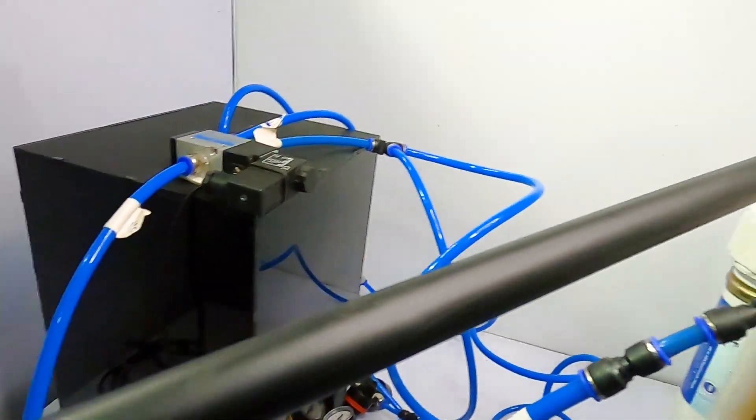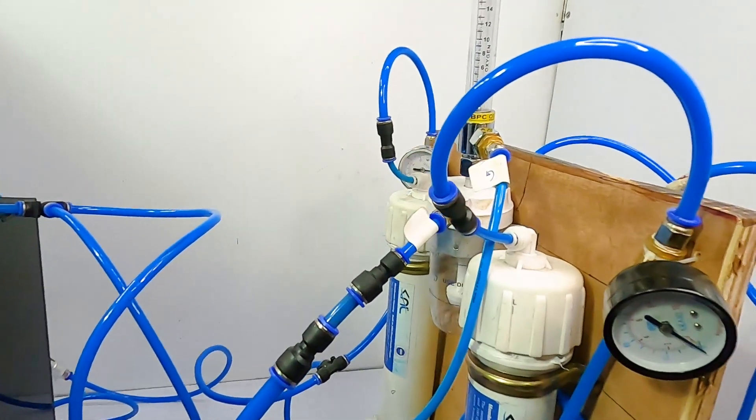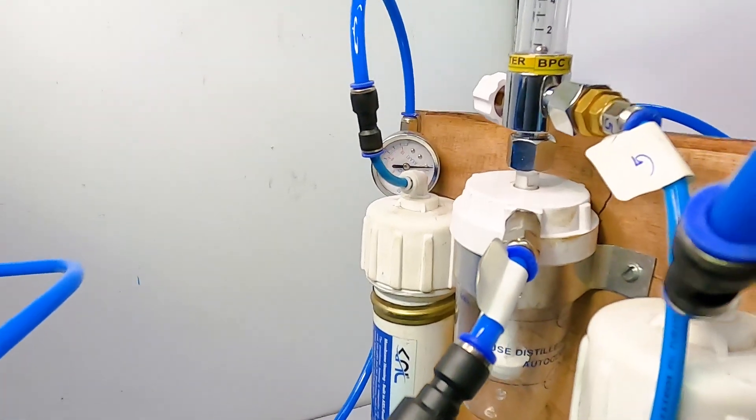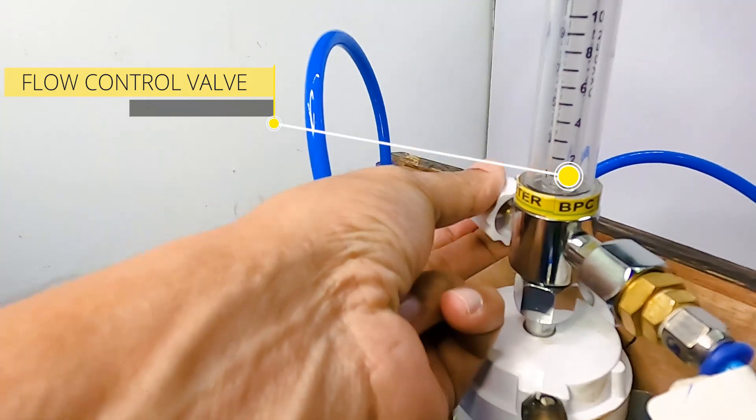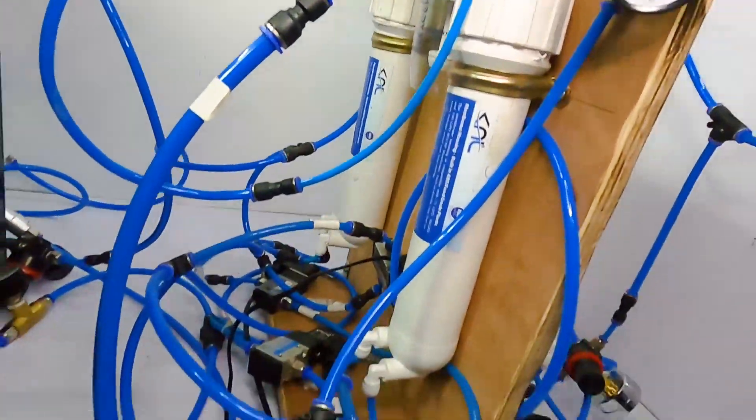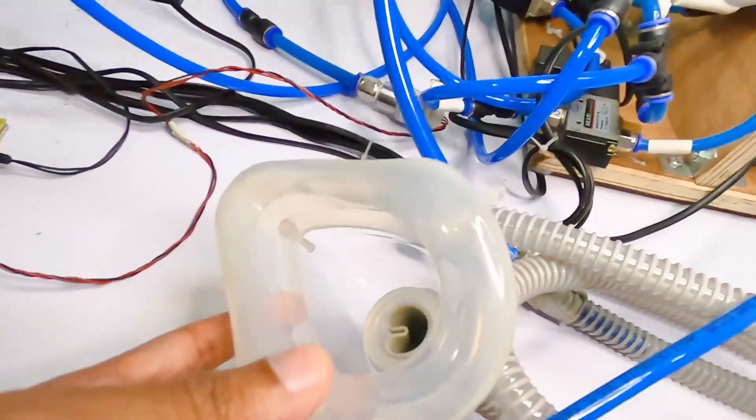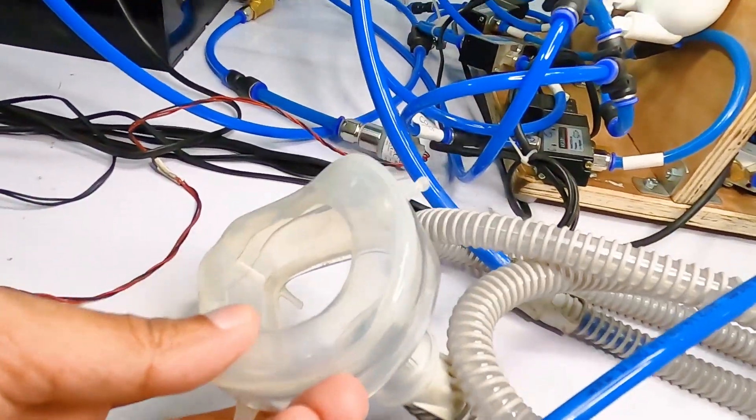So now this air can be passed through a flow control valve. As you can see here, we can use this control valve to control the flow of the output oxygen-rich air, and we have attached an oxygen mask here at the output on the other side of the flow controller.